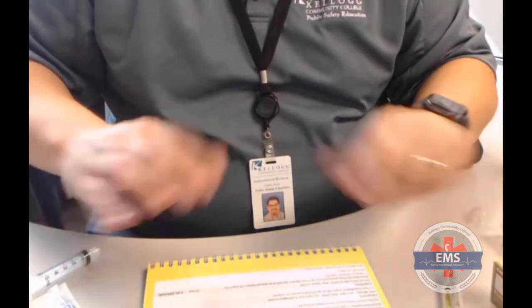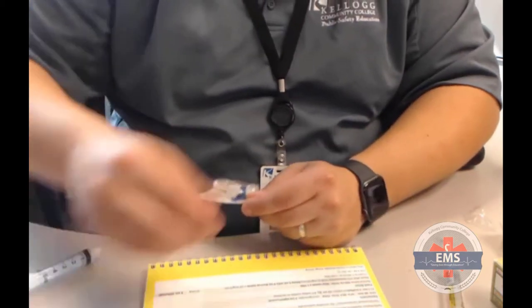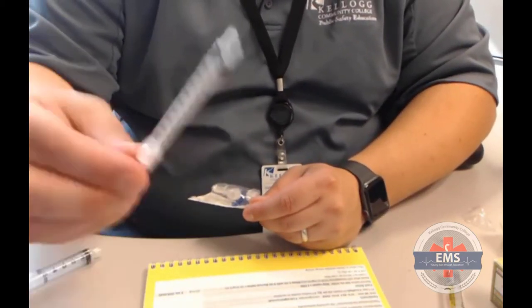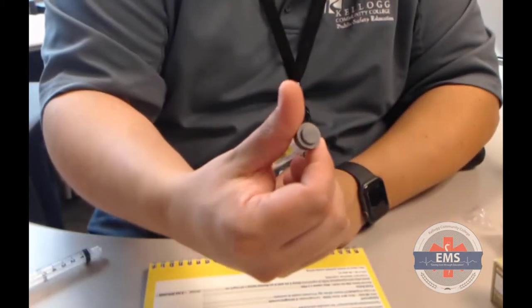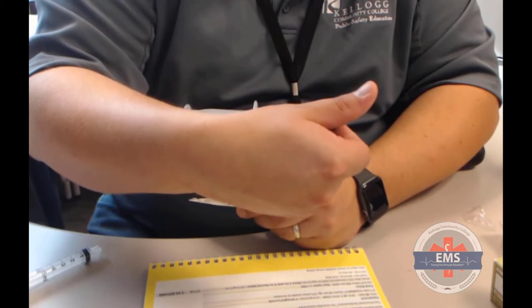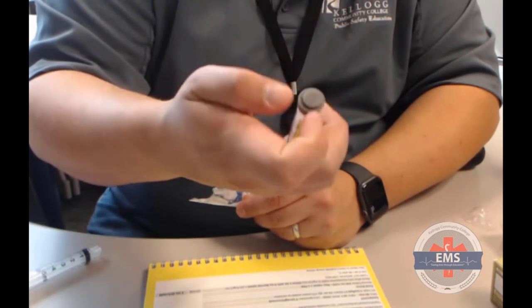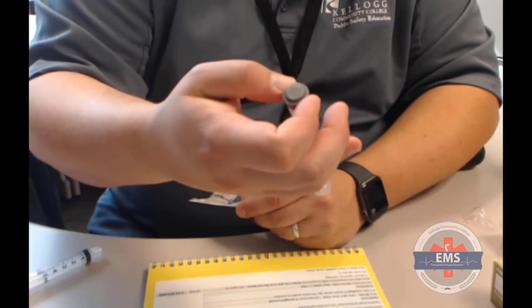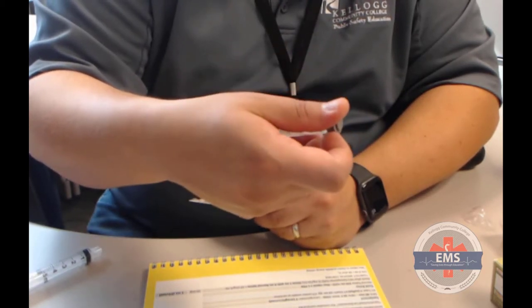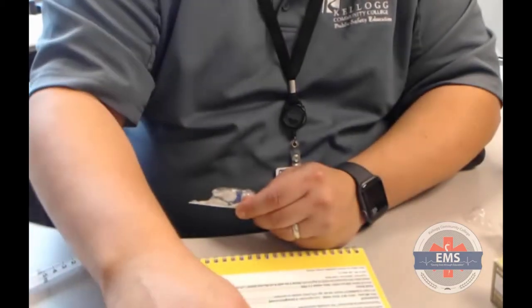I would make sure that as I draw this up, I've got all my supplies that are necessary, which include a smaller syringe, in this case a 1 milliliter syringe. I've got my medication, and I've made sure that my medication is in date. It does show that I'm dealing with lidocaine, 2% lidocaine. Here it's 100 milligrams in a total of 5 mLs, and I'm also dealing with 20 milligrams per milliliter. Again, I can reference that very easily here on my medication box.